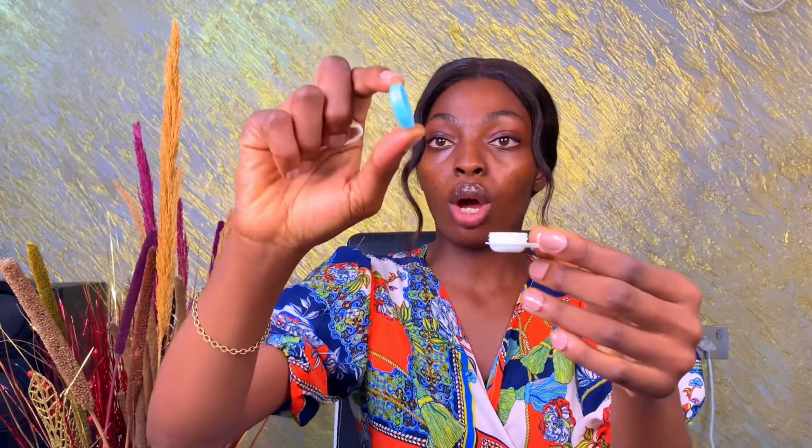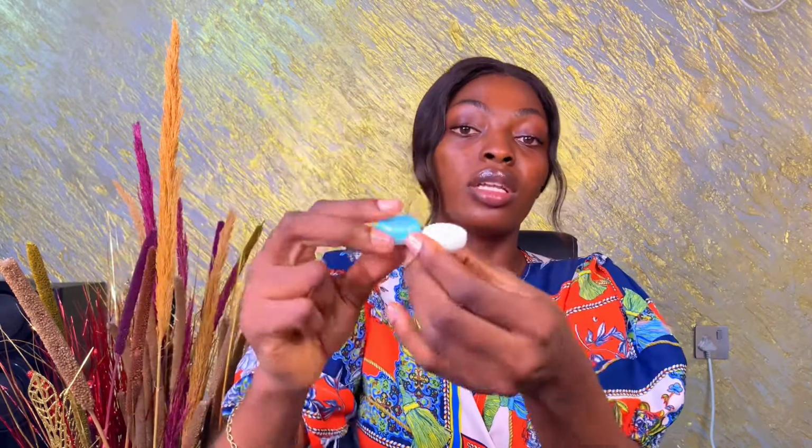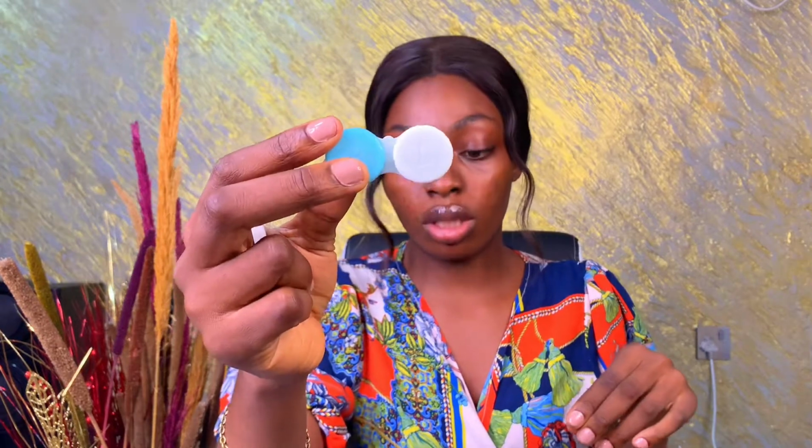Okay, when you're done with that, you want to take your tweezers and pick one of the lens and put it inside. You pick it and you put it, and please cover with the correct one. So I just picked the right contact and I'm covering with the right cover, and you want to do the same for the left. So I've picked and I'm putting it inside, and I'll cover it. This step is very necessary. Now you have a fresh solution, and I'm sure your contacts will be free of all the germs that must have stayed in while you did not use it.